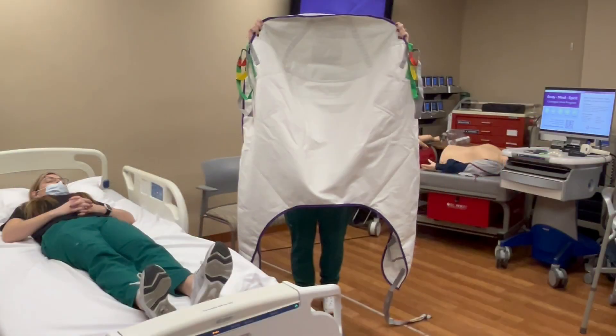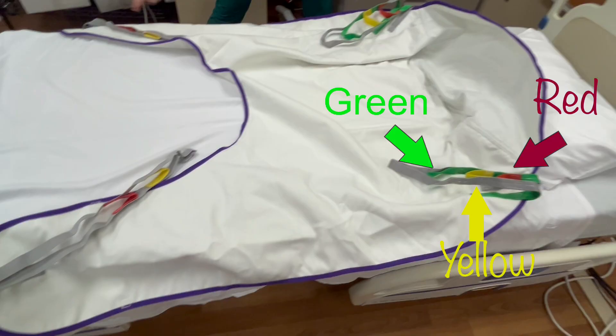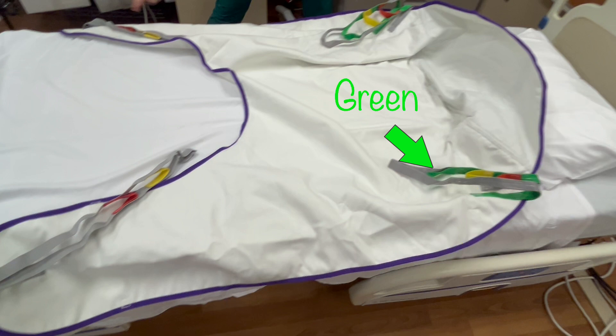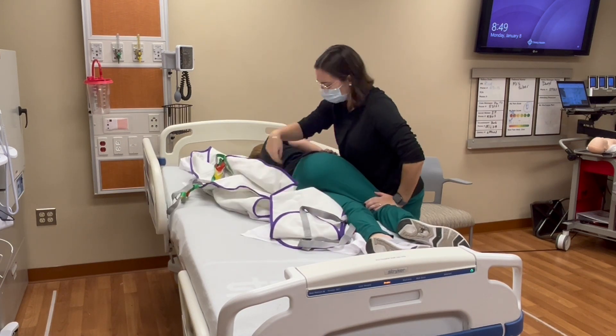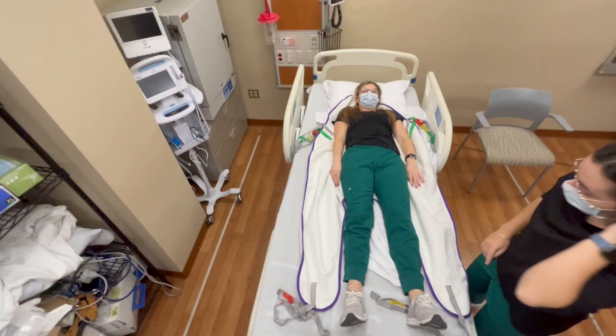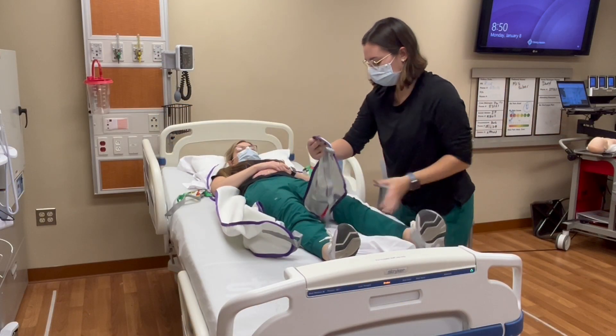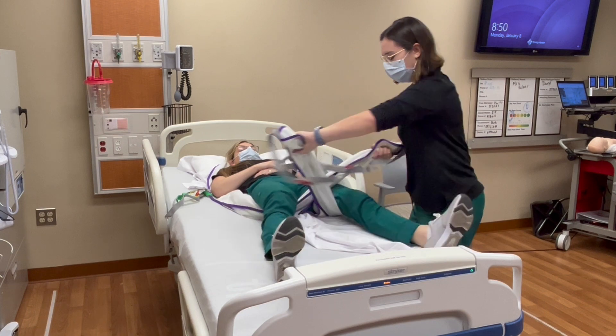The seated sling has the patient positioned with their head toward the large portion of the sling. There are four straps — two near the head and two near the legs — each with color-coded loops. If you use the green loop on one side, you must use the equivalent green loop on the opposite side to keep the sling balanced. This sling can be applied while the patient is either supine or seated. When the patient is supine, use proper rolling and repositioning technique to get the sling under the patient, similar to changing sheets in an occupied bed. Position the patient's head at the top of the sling, with the legs between the sling's legs. Tuck the sling's legs under the patient's legs, pulling them across and draping them over the opposite leg. If the patient is seated, bring the legs of the sling around the patient, tuck them under the patient's thighs, and criss-cross them over the patient's legs.